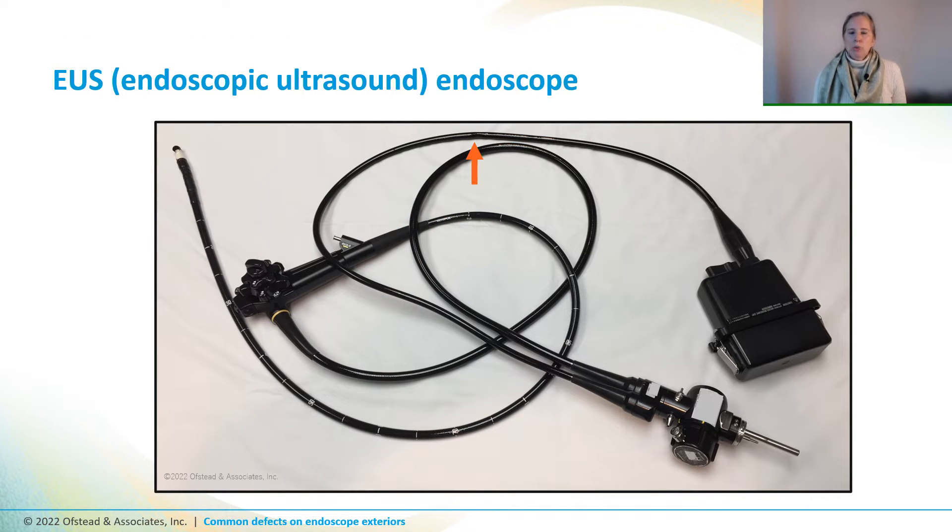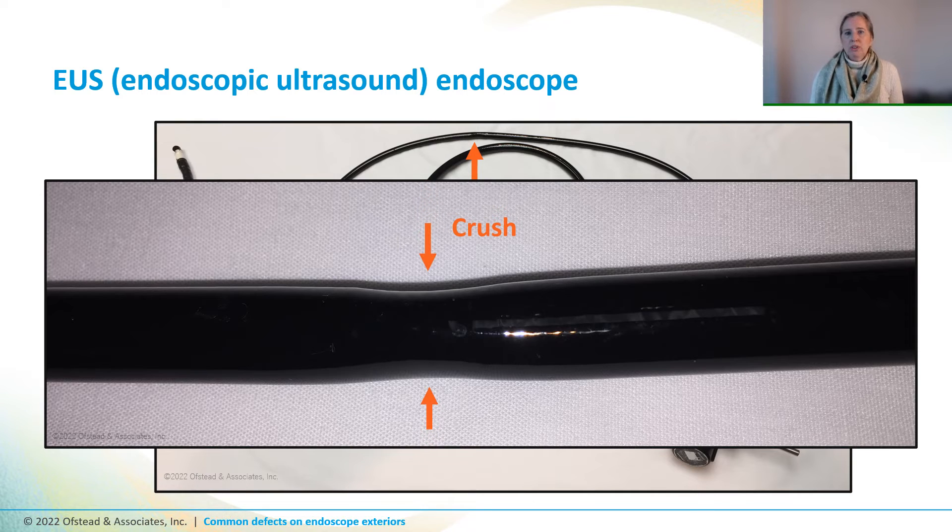Here's an EUS scope where the universal cord was dented. And when you take a closer look, you can see that the dents are on both sides, which we call crushing. That can happen when a cabinet or a cart door squashes it or when someone leans on it.